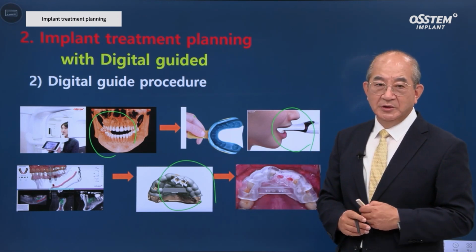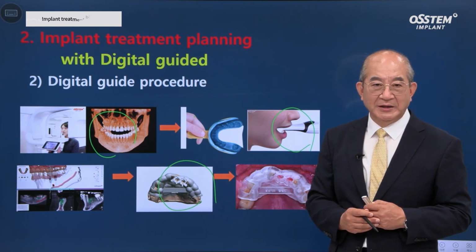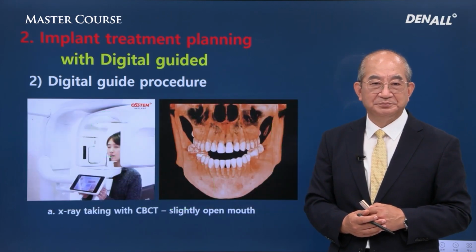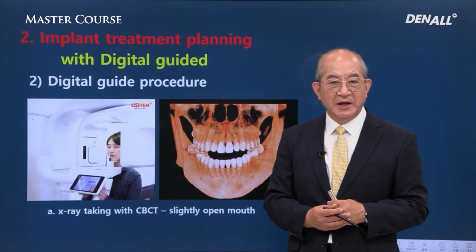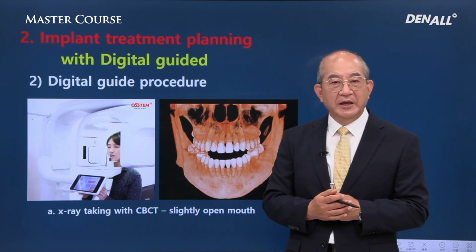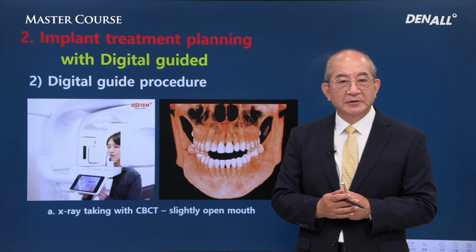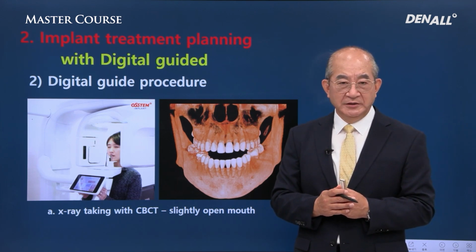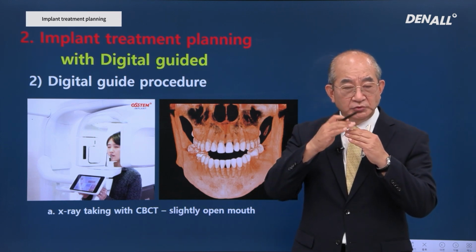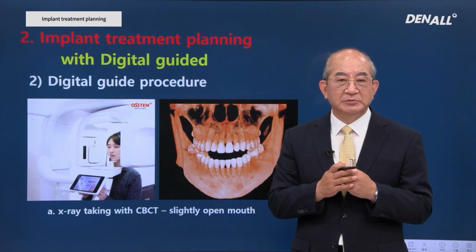You can use these guides to do implant placement if the patient came in general. This is the same as X-ray. When you utilize digital dentistry using CBCT, superimposition is very important. Although you can get good data in the posterior region, that may not be so in the upper central area where images may be overlapping, and we need to avoid this.